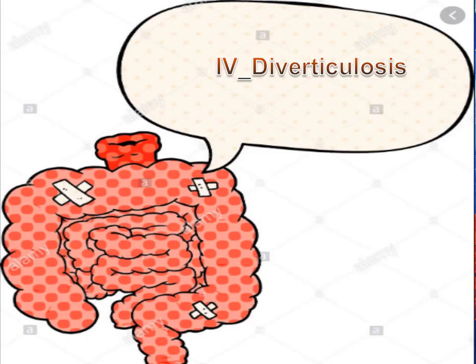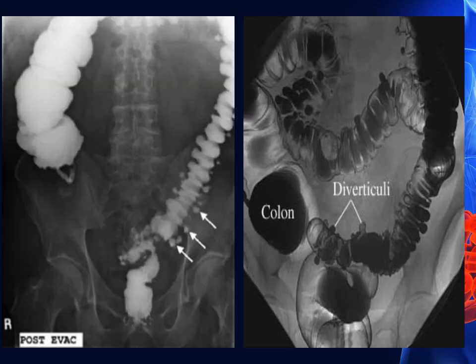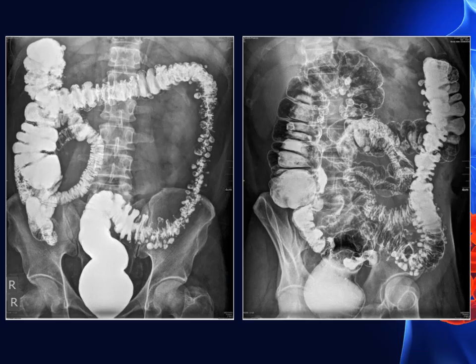The fourth pathology is diverticulosis. Diverticulosis refers to the presence of multiple diverticula, which are outpouchings of the hollow viscus. The contrast is escaping outside the lumen but still delineated — you can see small loculi of contrast lying beside the bowel as diverticulosis. Here in a negative study you can also see the diverticular outpouchings from the wall.